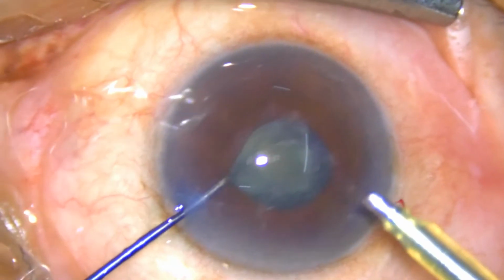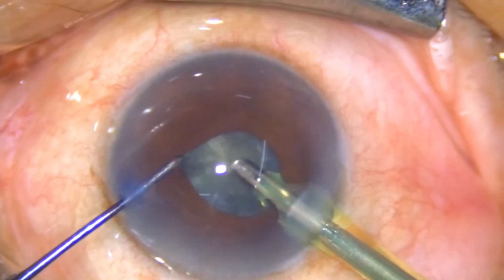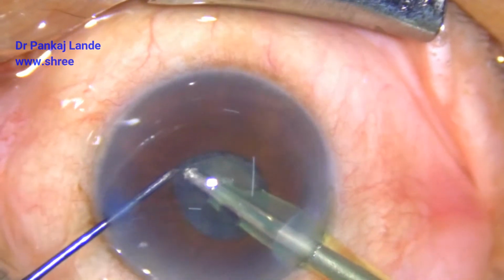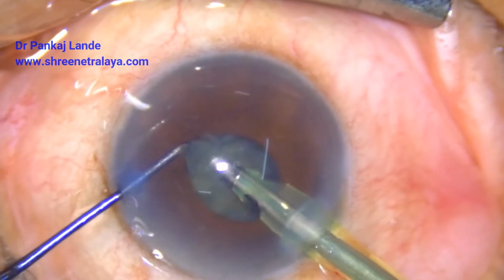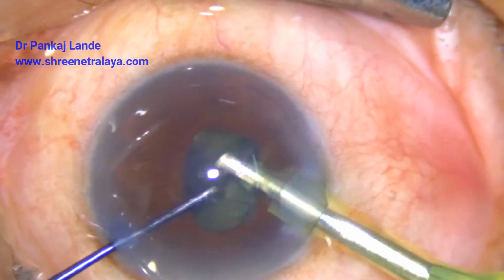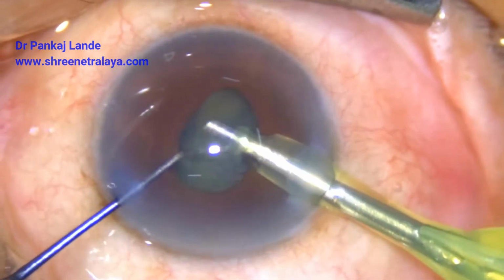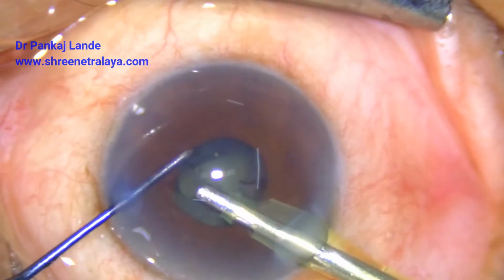Use preferably a long chopper. You should have a stable anterior chamber, so take care of that. A long chopper is always helpful in small pupil cases, but you need to have a good expert hand. Try to hold the nucleus in the center and tilt it. Once you have tilted the nucleus, you can chop.